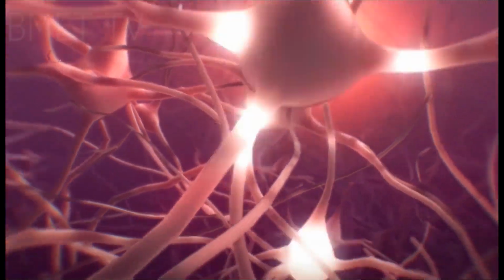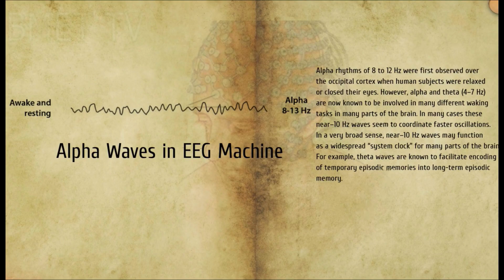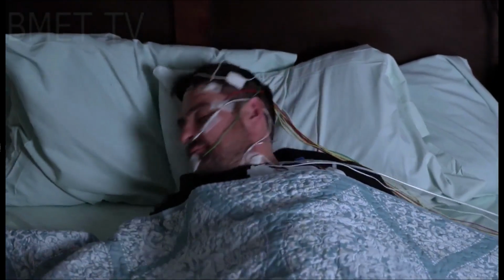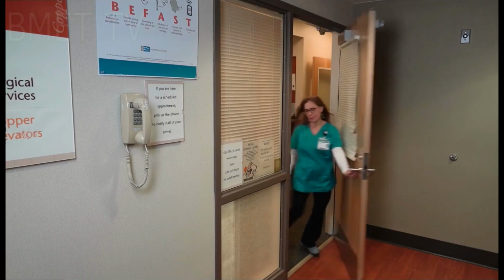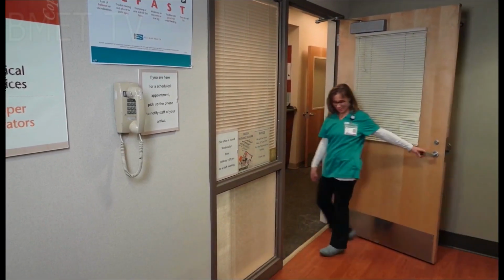Third is alpha waves. Has a frequency between 7.5 and 13 Hz. Is usually best seen in the posterior regions of the head on each side, being higher in amplitude on the dominant side. It appears when closing the eyes and relaxing, and disappears when opening the eyes or alerting by any mechanism, thinking, calculating. It is the major rhythm seen in normal relaxed adults. It is present during most of life, especially after the 13th year.